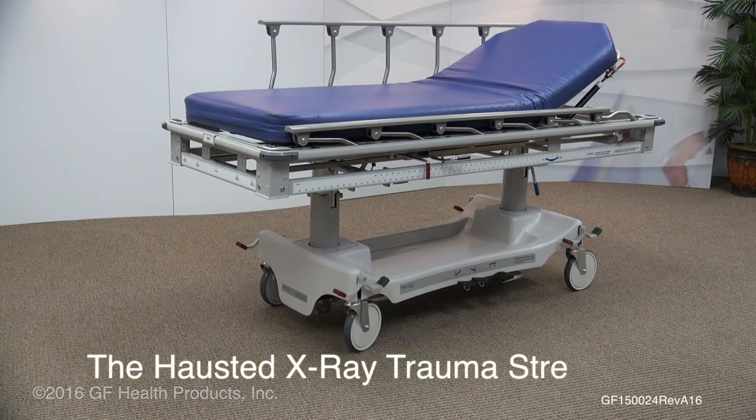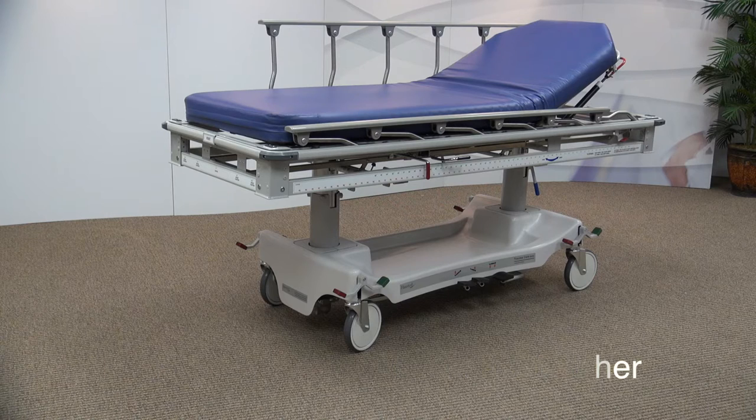Welcome to the X-Ray Trauma Stretcher Overview. Whether in triage, radiology, or treating critical patients, this stretcher provides the functionality and security needed for trauma situations with the mobility of a stretcher. Let's walk you through the features and benefits of the X-Ray Trauma Stretcher.